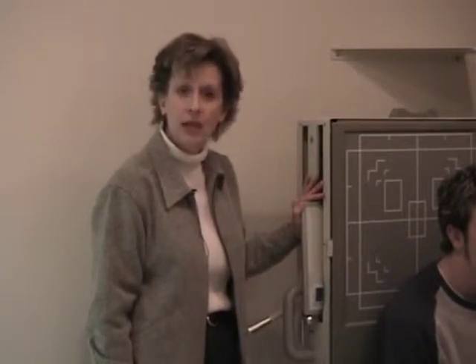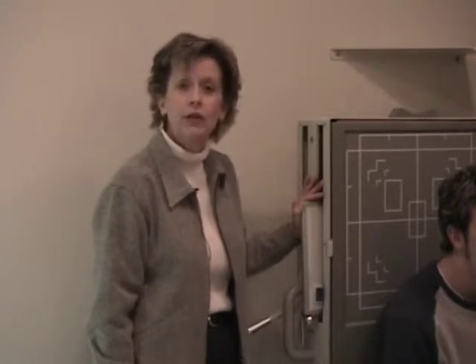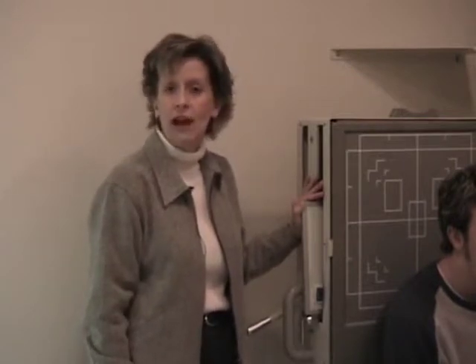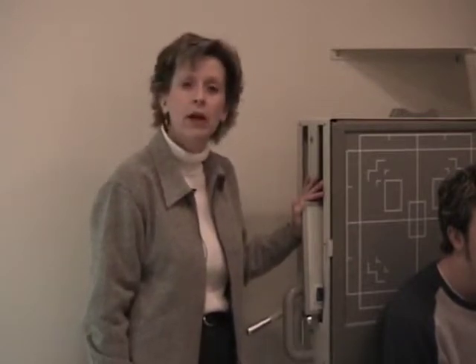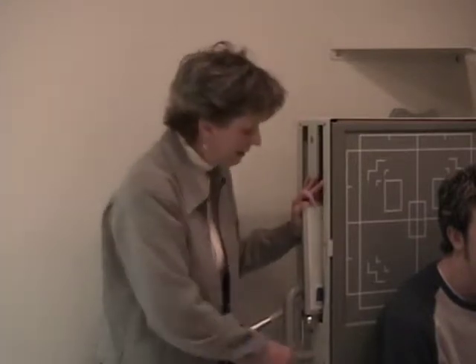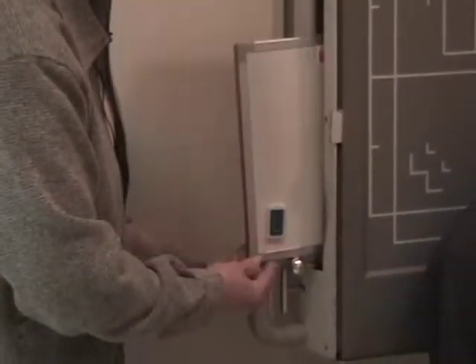You're going to do a PA and you're going to do a Waters, you're going to do a lateral, and then you're going to have a choice of either the SMV or the axial. So you can see the similarity with the facial bones. So we'll just go right into our lesson today. 8 by 10 cassette lengthwise, marker moved in a ways.